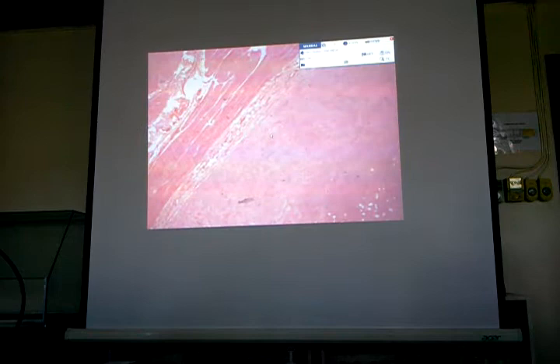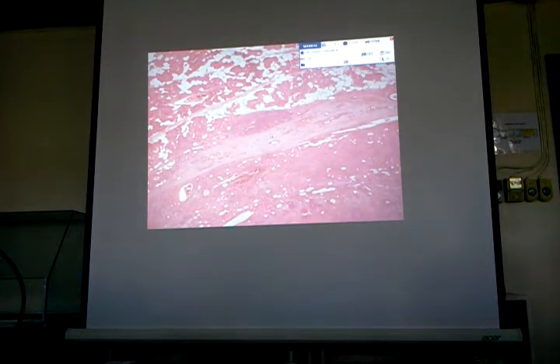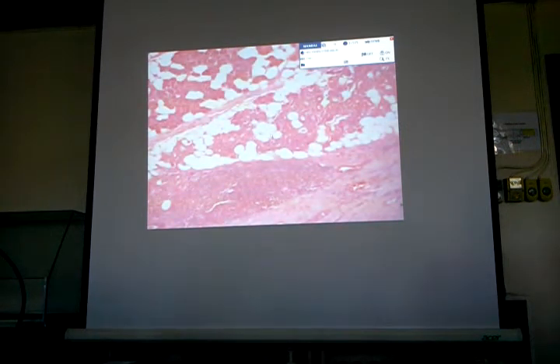Our next slide is pleomorphic adenoma. Okay, we will begin with the normal parotid gland. What is the classification of the secretion of the parotid gland? Okay, purely serous. So the histology will show us only serous acini, and then those are the ducts, intralobular or interlobular ducts. They are amongst the secretory acini.